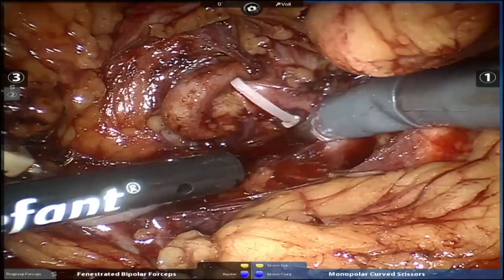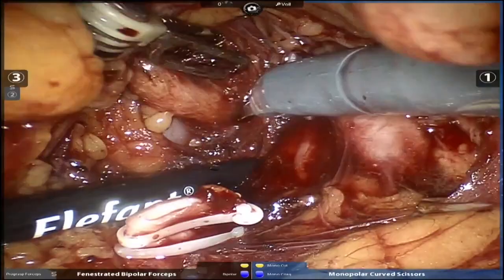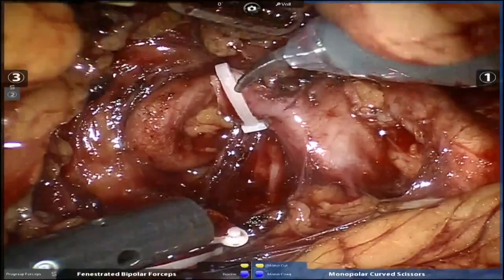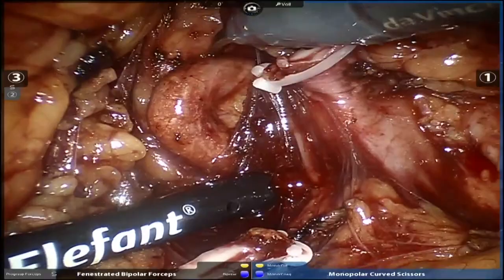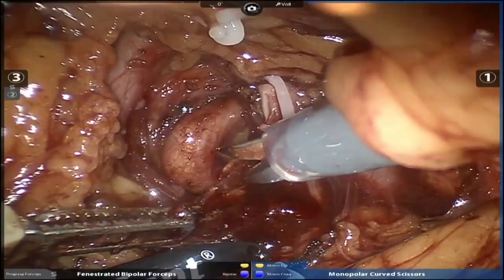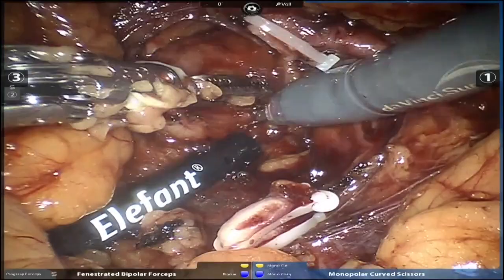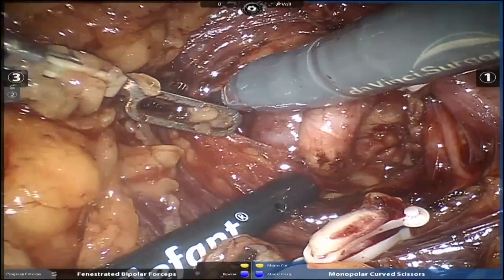Suck right there, please. Good. And see what the hell this thing is. Mm-hmm. Maybe it's a branch. Yeah. Uh-huh, suck. It's a huge vein. Yeah, it's interesting, isn't it? I don't see this kind of vein on the imaging. I don't know where this is coming from.